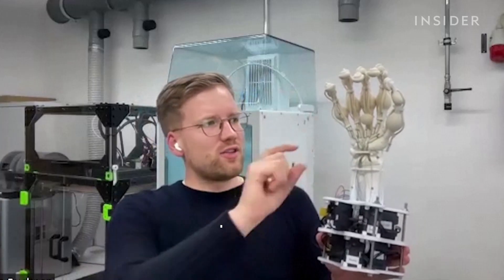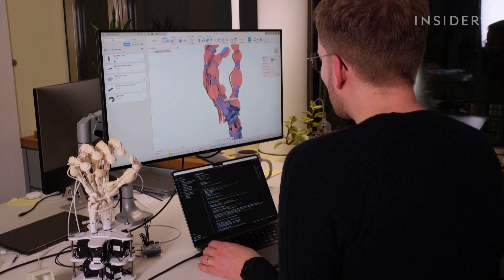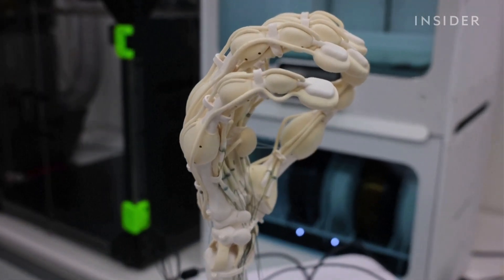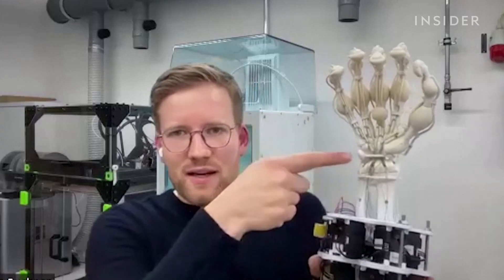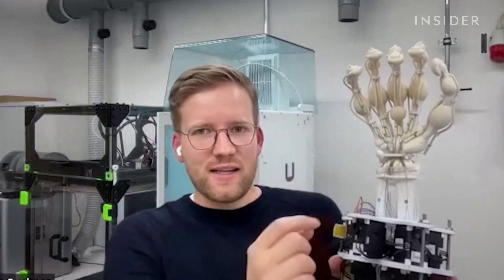We used MRI data that is openly available to model all the bone structures, just like in an actual human hand. We have sections of soft tendons and capsules around the joint areas, and tendons that are internally reinforced with a rigid material to have a load-bearing structure. Here we have fishing line tendons that interface with the actually printed tendons and connect them to these motors down here.